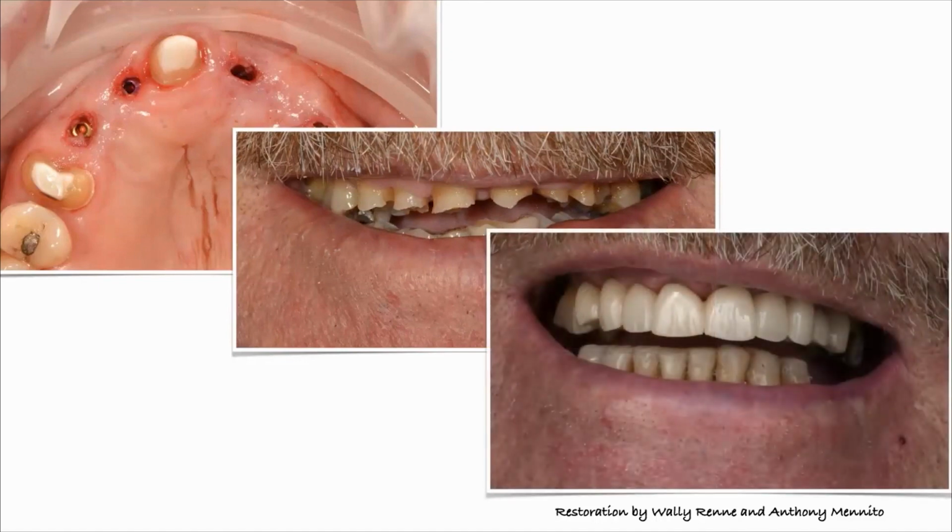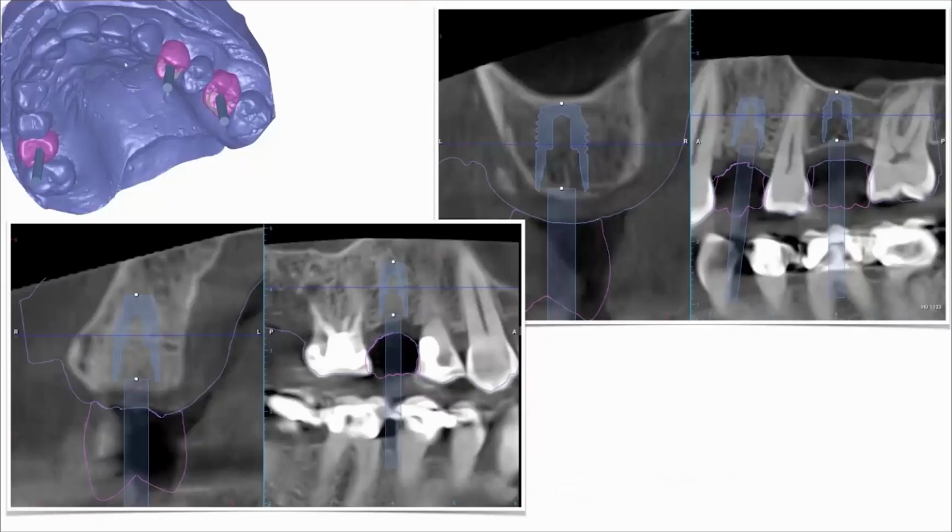They've been having some incredible results with 3D printing of temps, all based off these simple digital workflows that we've talked about. And by the way, this patient has not been able to afford his final prosthesis. He's been wearing 3D printed temps for, I think, over a year at this point. So they can work very well. There are a lot of naysayers who challenge us on that.